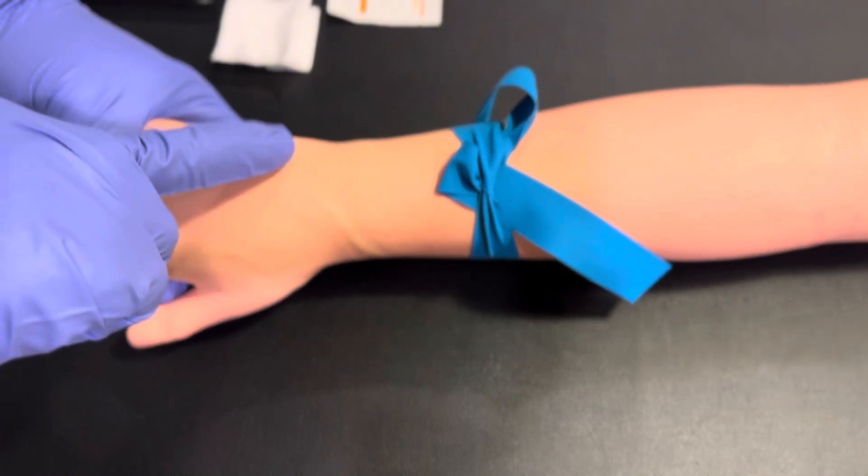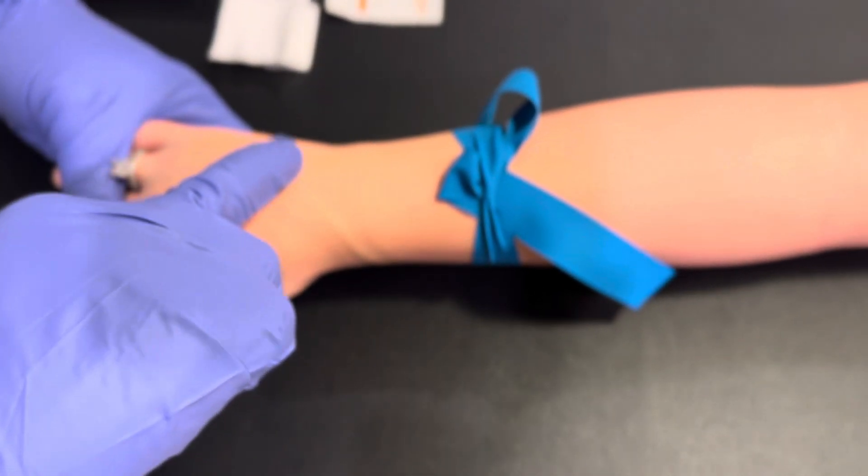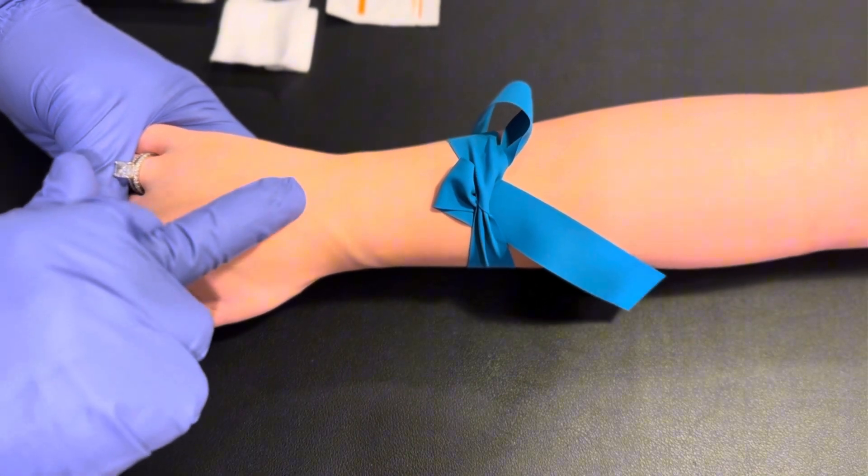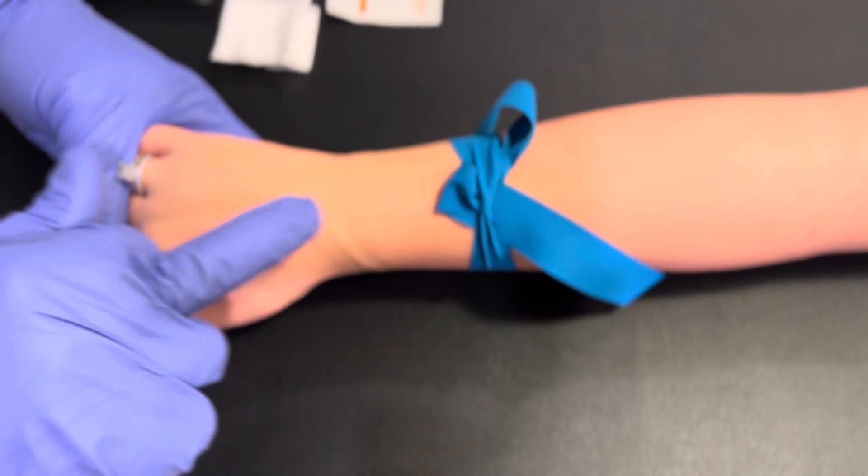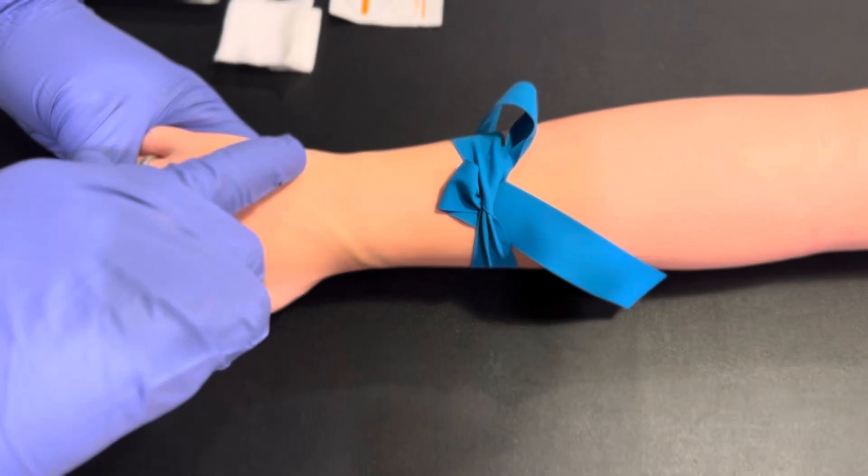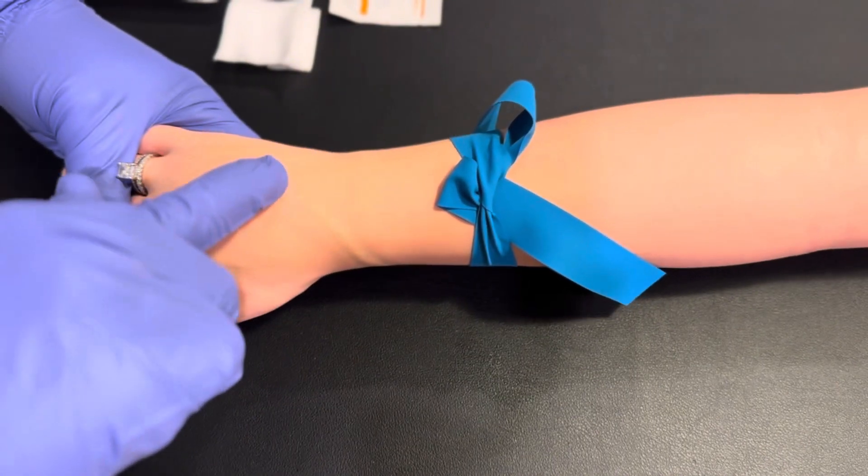Once the tourniquet is applied, allow the veins to dilate and using your index finger or middle finger palpate for the vein on the dorsal hand. Please make sure you select a site where there's soft tissue and please stay away from the bony regions of the dorsal hand veins.